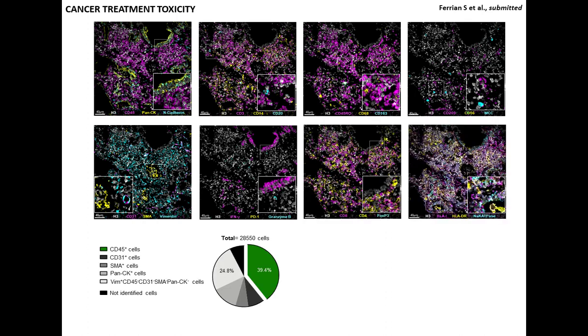The majority of T cells were CD4 and expressed CD45RO and HLA-DR antigens. We also observed diminished FOXP3 regulatory T cells, consistent with the pro-inflammatory phenotype observed here. On the other hand, the majority of CD8 T cells lacked granzyme B, while the macrophage-infiltrated areas surrounding the gastric epithelium lacked HLA-DR and interferon gamma.